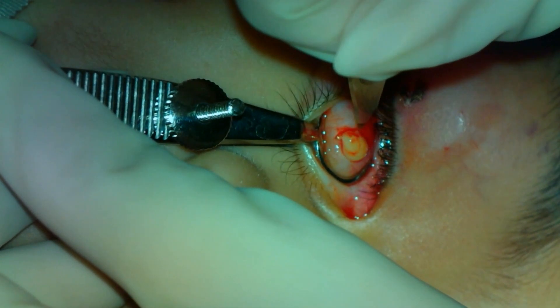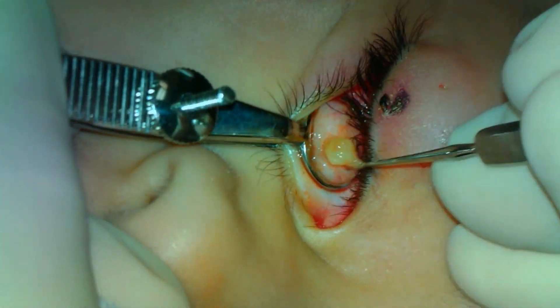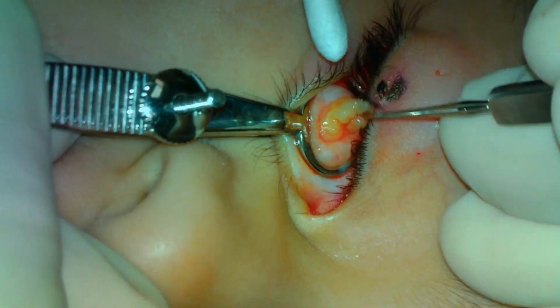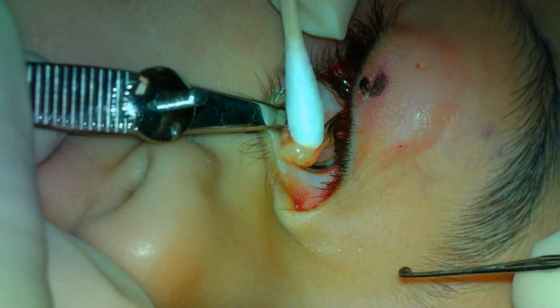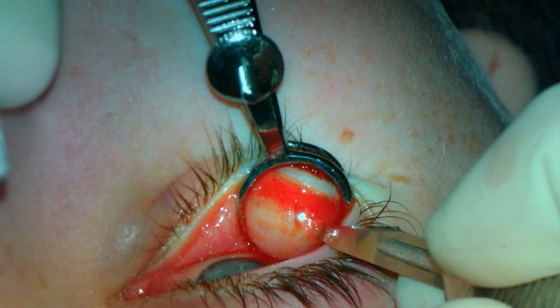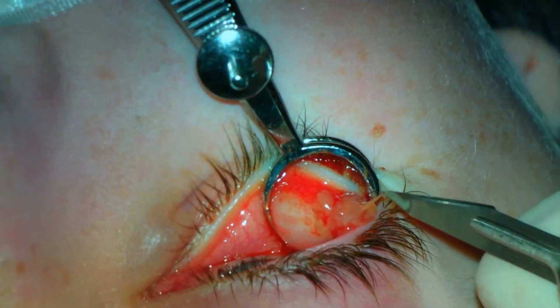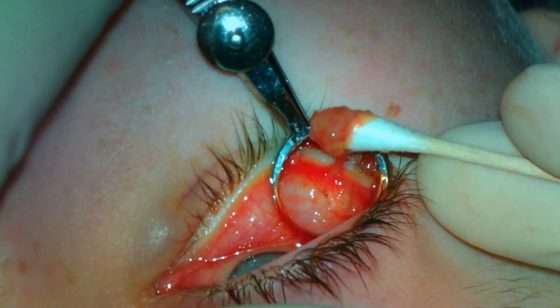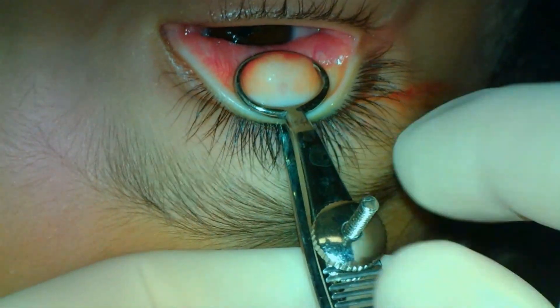The third lesion is on the lower eyelid. The clamp is placed on the eyelid, followed by incision with the 11 blade. The curette is then used to aggressively remove the contents of the chalazion. I usually do not remove any tarsus unless I am sending a piece for histopathological evaluation. My trainees are often too gentle with the curette, and I try to convince them to be more aggressive.